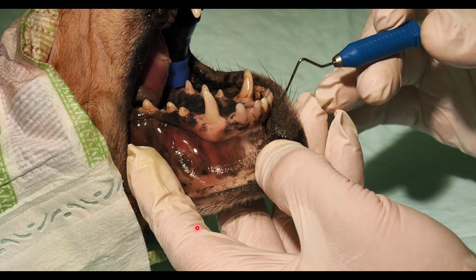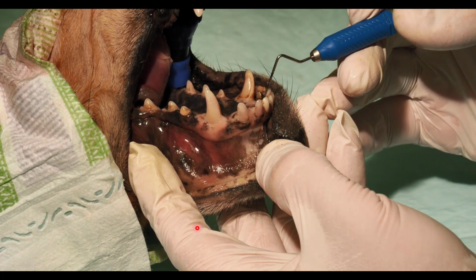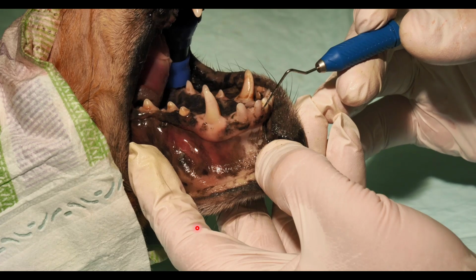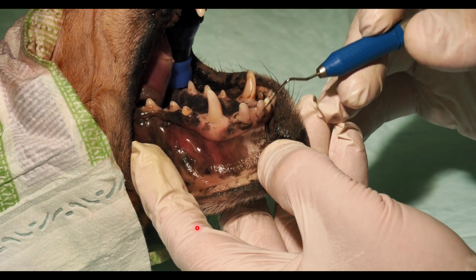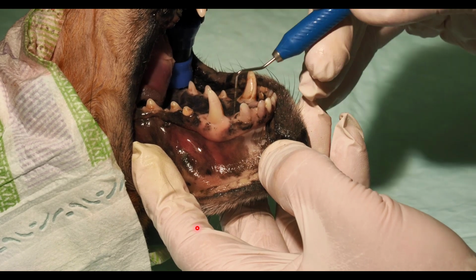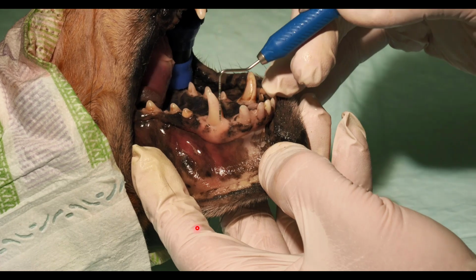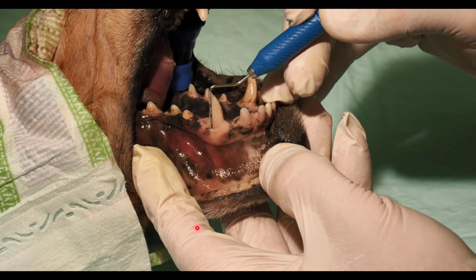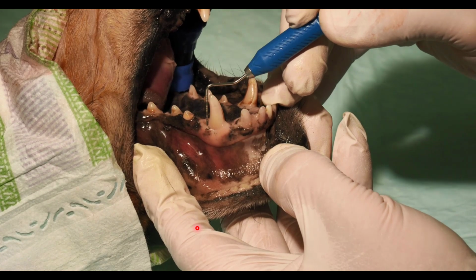So what we're going to do is angle slightly towards the tooth and just walk. Just tap, tap, tap, tap, tap all the way around the teeth, starting on midline and going around each tooth. So you can see all of these are nice and normal, so I'm not going to really say anything. I don't mark normal. When we get to this canine, you can see where it drops down here. That's dropping down to about a 5 millimeter pocket right there.